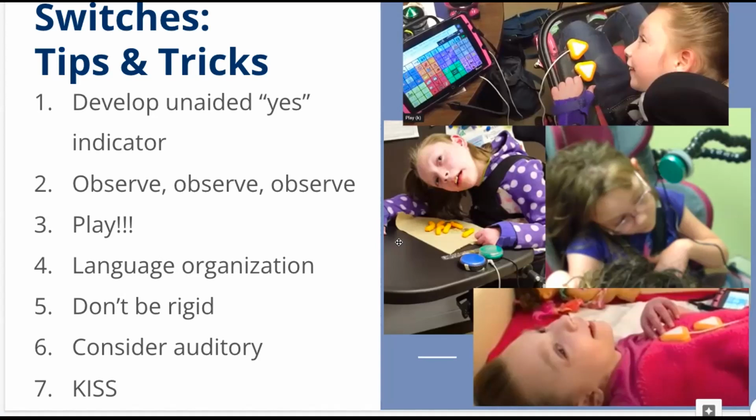It doesn't always have to be a hand. It doesn't always have to be a head. It could be an elbow, a foot, a knee. My single switch scanner, who was super efficient, would bend his calf. He hit the switch with his calf by swinging his knee. Incredible. He could single switch scan faster than I can.